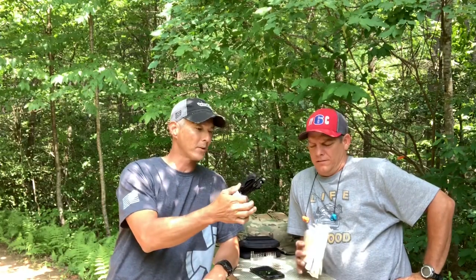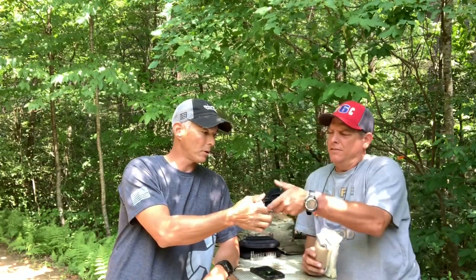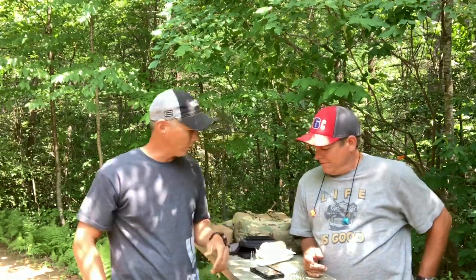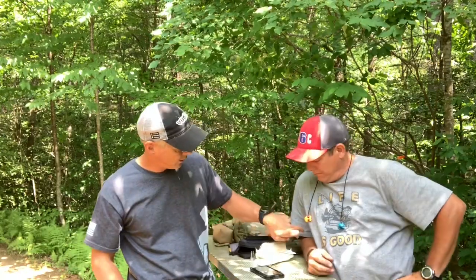I said, well, set your tourniquet up the way that you would have it if you were carrying it. So there you go, Rick, that's yours. I'm going to let you put it in your back left pocket. We're going to say Rick just took a round to here, and he's bleeding out bad. You've got your brachial artery that runs on the inside right here. You don't have a whole lot of time to get that stopped.